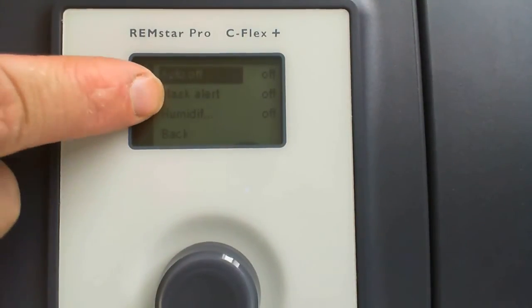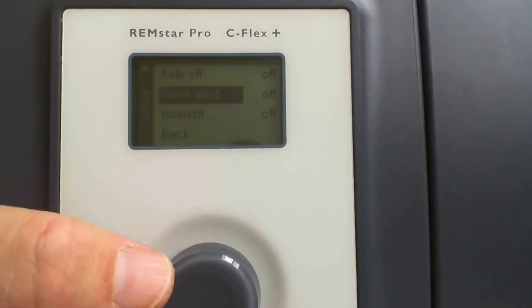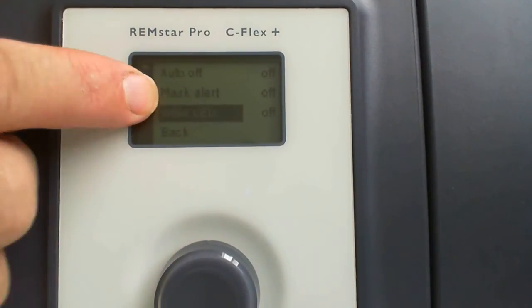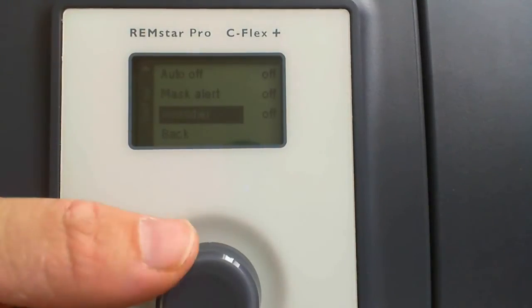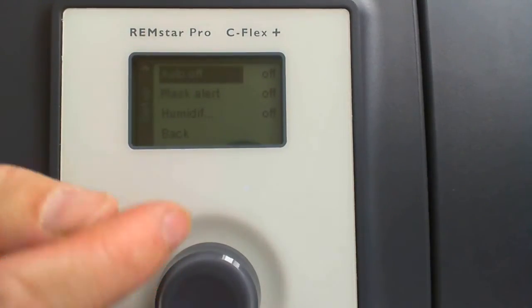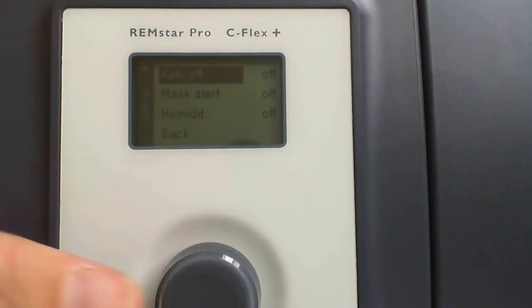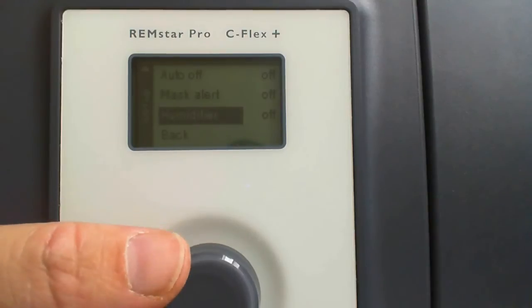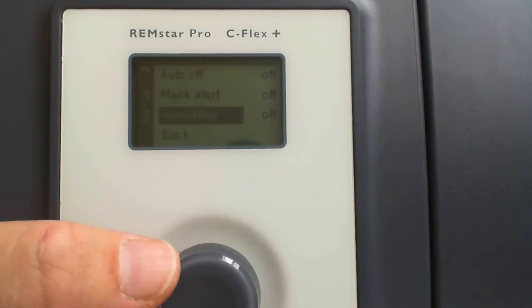If you're taking your mask off at night, this might be one you want to leave on. Because if you take it off at night, you leave the machine on. Now, if you shut the machine off, it's not going to help here. But if you take your mask off at night, a very common problem for people adjusting to CPAP, this little audible alarm is going to get you to put it back on. So if you can hear it and you wake up by it, this is a good feature to leave on if you're taking it off at night.